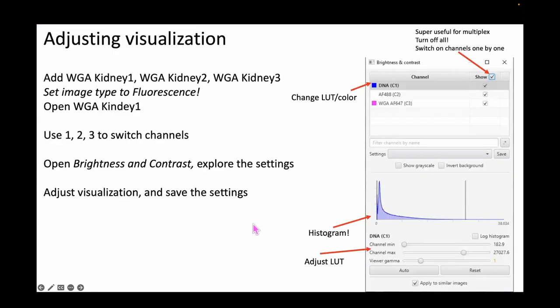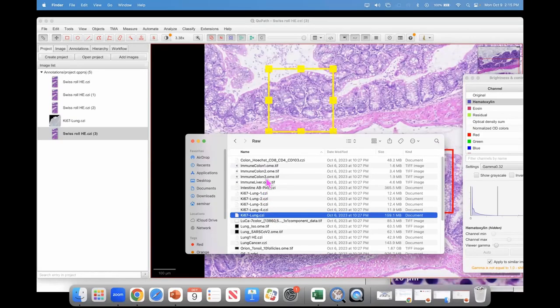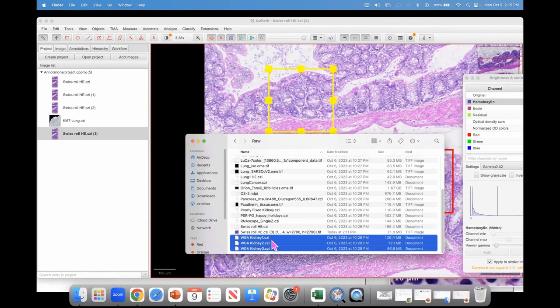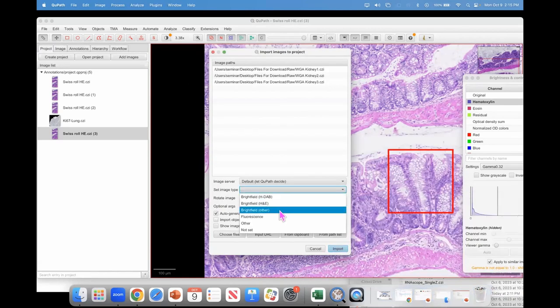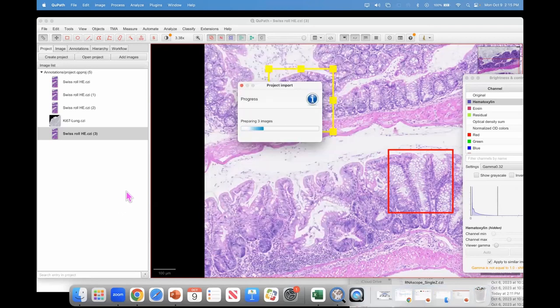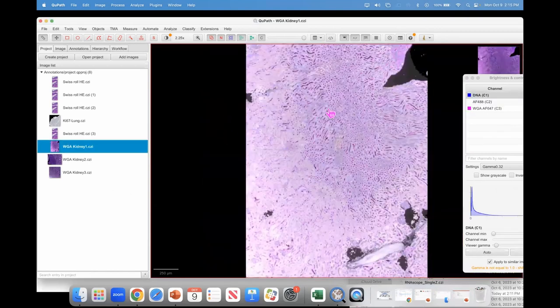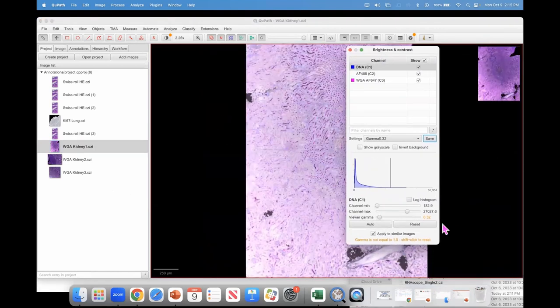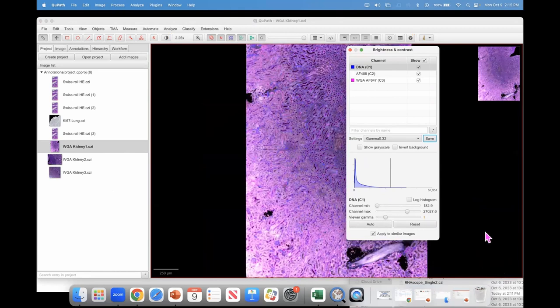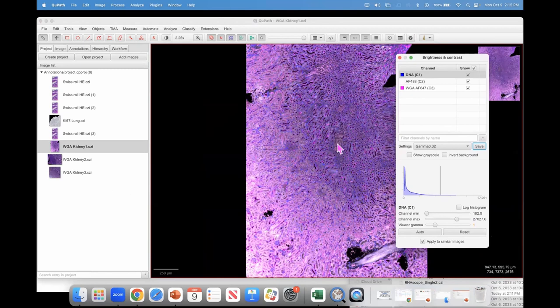We've been playing with the H&E image; now let's add the kidney WJ 1, 2, and 3 images to the project. Those images are fluorescence, so I can select that type when importing. When I switch to that image, a badge appears indicating something needs attention — and that's the gamma. When working with fluorescence images, it's best to switch gamma to 1.